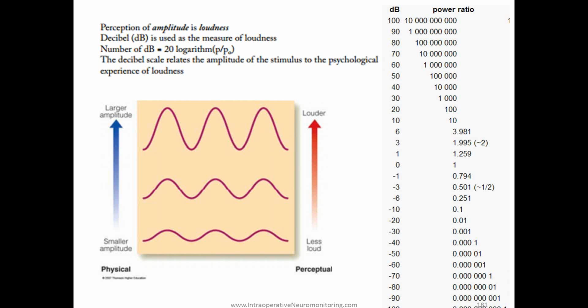So now on this right side, we have this chart where we're looking at decibels versus the power ratio. And it's from that equation that's up there on the upper left-hand side. It's easy to see a pattern here, and it's kind of a cheat sheet for when you get asked a question that is asking you to convert decibels to a power ratio or vice versa.